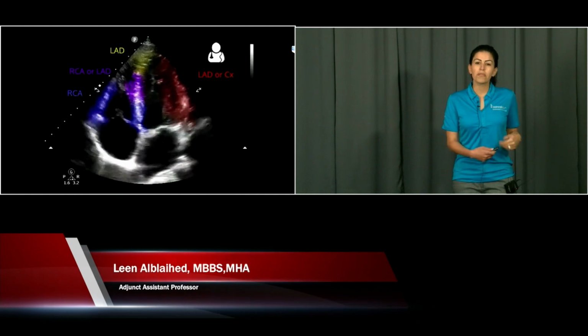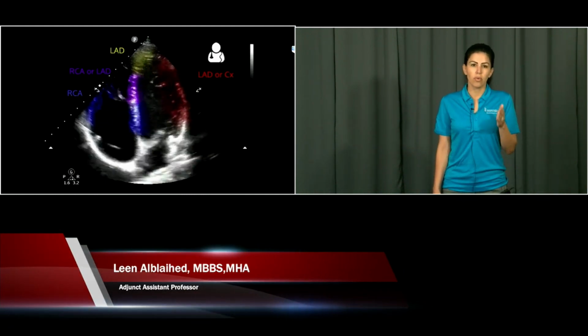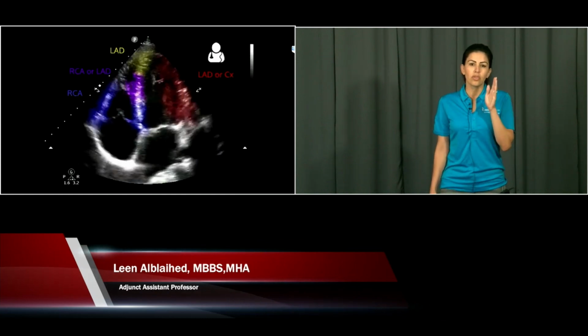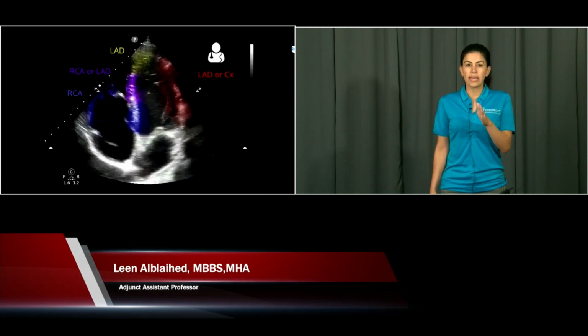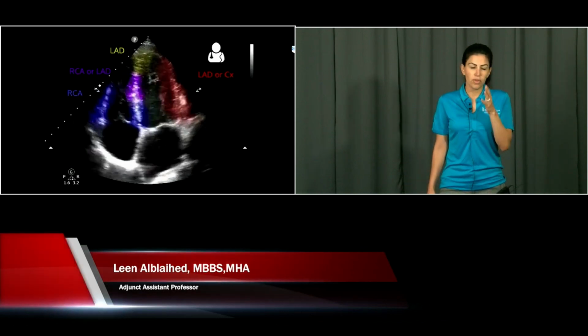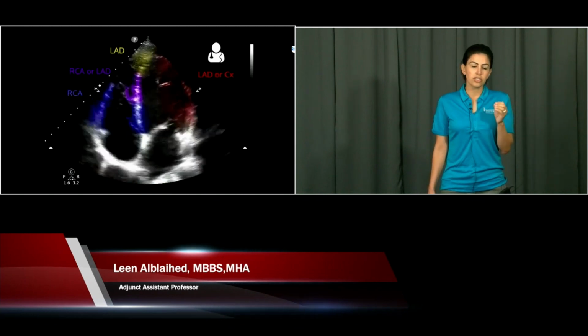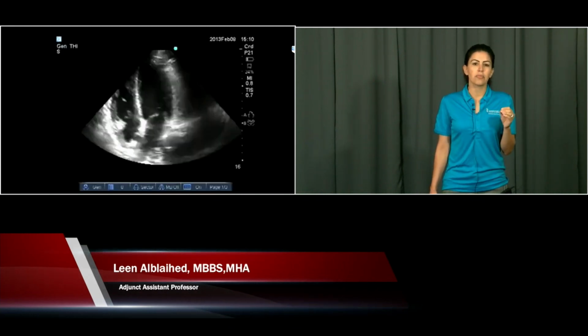If you get an apical four-chamber view, you can also determine the same thing. Wall motion abnormality, you look at the thickening and thinning. Again, each wall corresponds to a different vessel, but whether you memorize it, whether you have this as a reference, ultimately, I just want you to be able to diagnose that there is an abnormality.